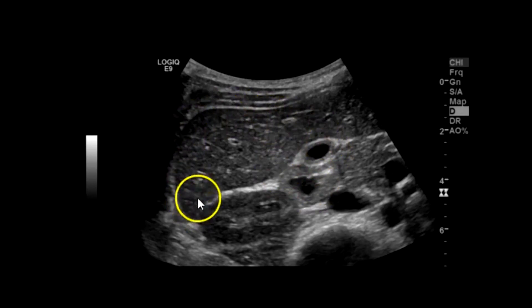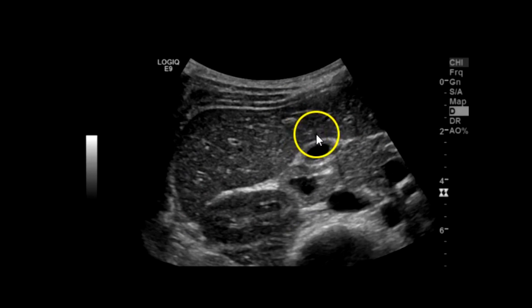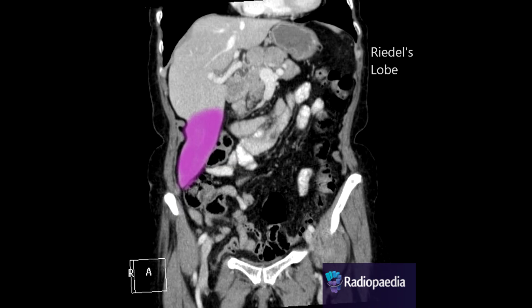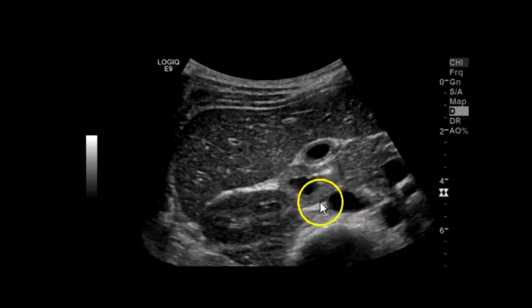The liver is divided into left lobe, right lobe, and caudate lobe. Some people have a segment called a Riedel's lobe, which is a long protrusion of the right inferior tip of the liver — it's commonly seen in thin women. And here you've got your right kidney and IVC.